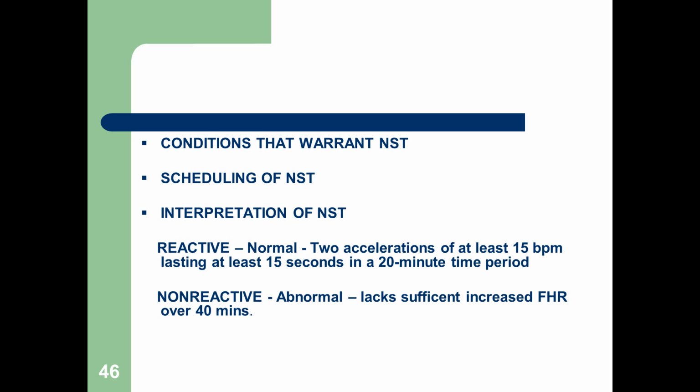Conditions that warrant a non-stress test. They're usually useful in clients with diabetes, PIH, or intrauterine growth restriction, spontaneous rupture of membranes, patients that are post-dates. These conditions can lead to decreased uteroplacental function, which means decreased oxygen to the fetus, which equals asphyxia.